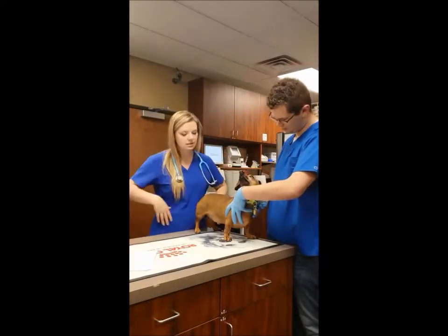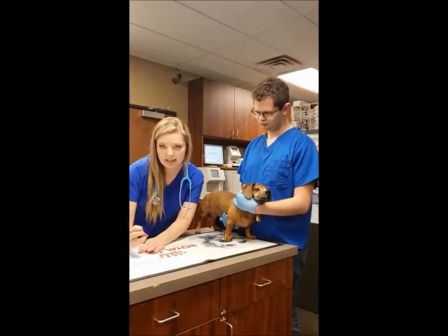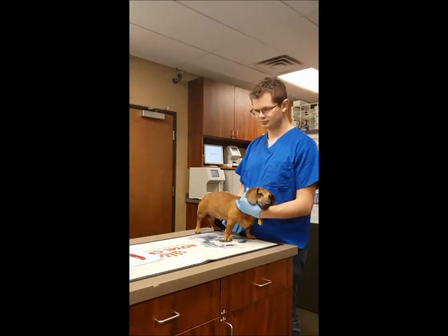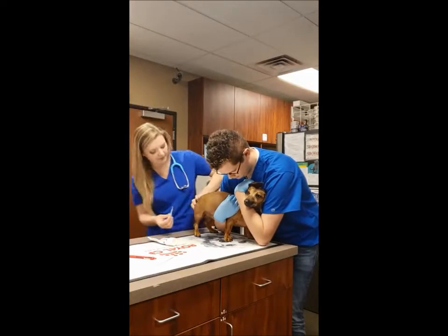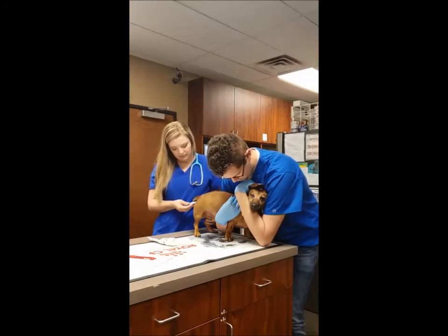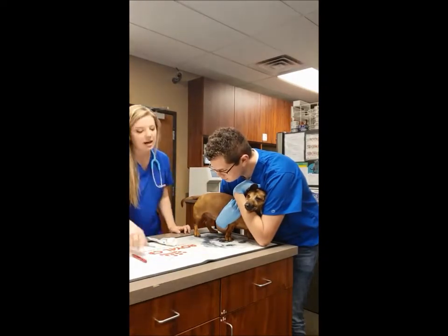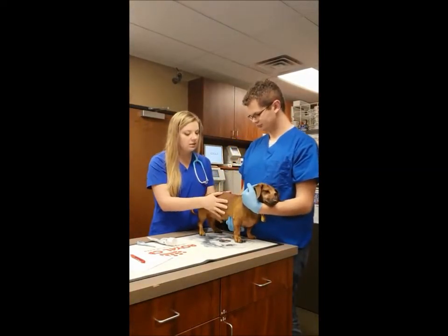Okay, heart and lungs sound great. His pulse is 120. His respiratory rate is 30. I'll go ahead and get a temperature on him. Our temperature is normal. It is at 101.3. And I give him an ASA grade of 1 because I do not see any significant illness with this patient.